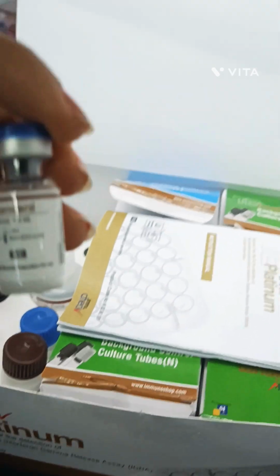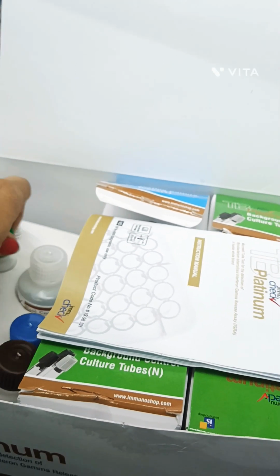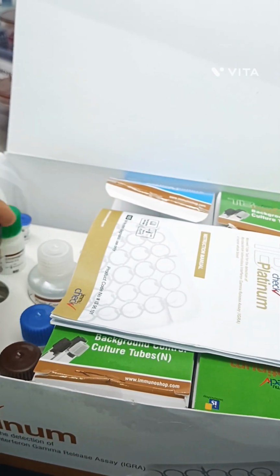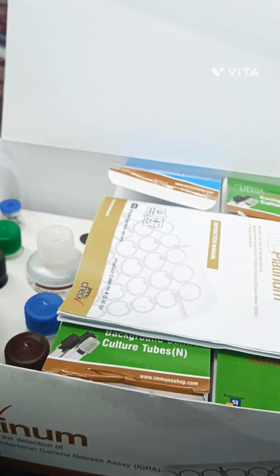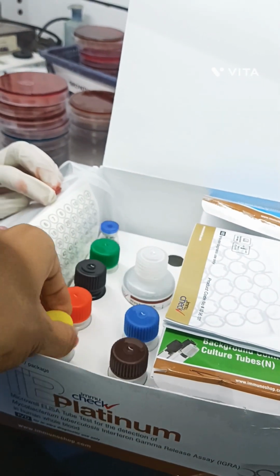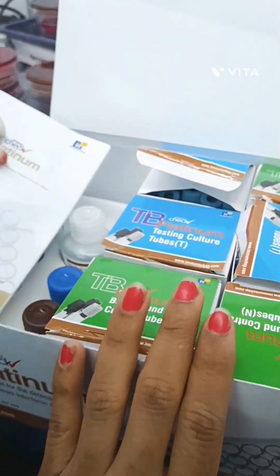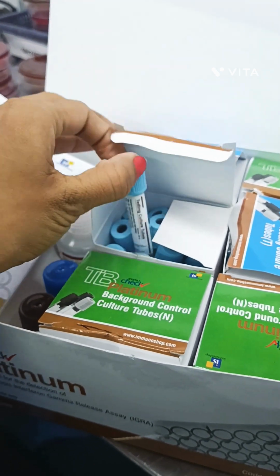This standard is used for kit validation when we have received a new lot. So every lot we have to process standards also. This one is for chromogen solutions. These A and B solutions we are using, and the last one is stop solution. So all these reagents are for ELISA.